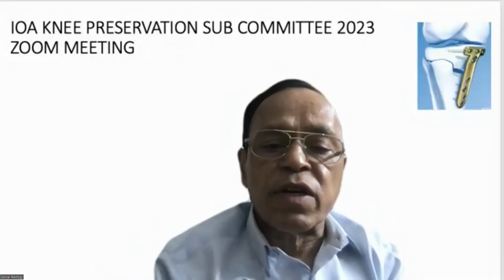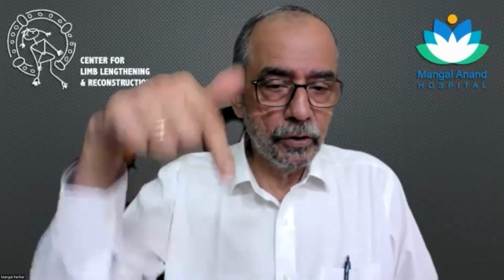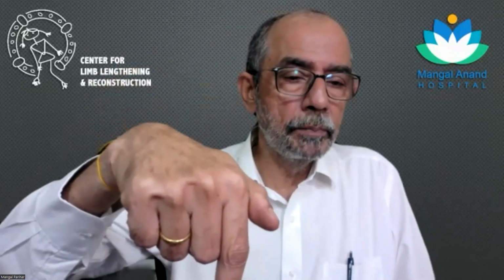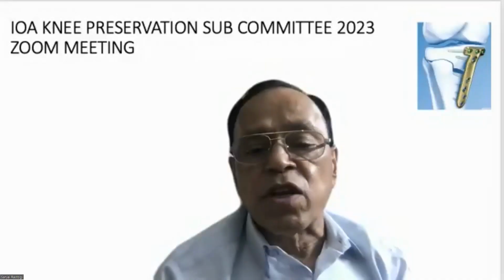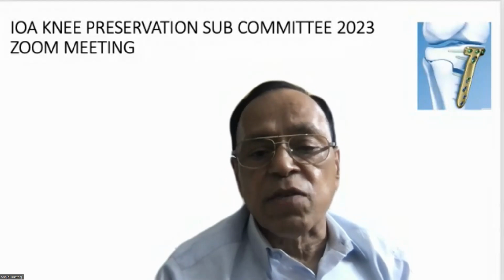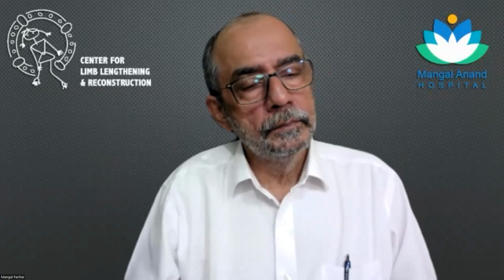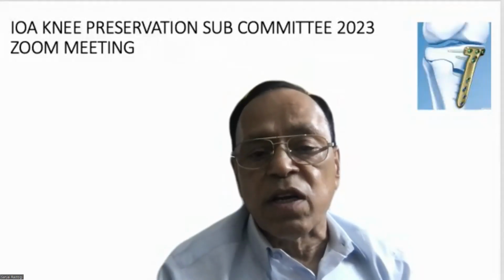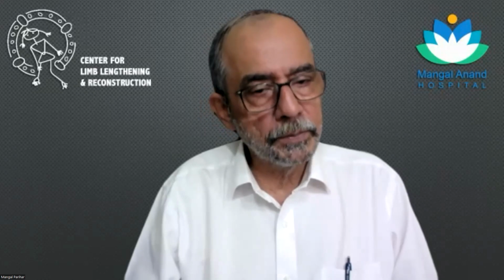Right. So what is the advantage of pie crusting once you have released it? Even after release, sometimes if you've done a large correction, you can't insert your finger between the plate and the MCL. It gets actually strangulated. By release, I'm talking of a distal release, not a transverse release. The distal release is, you see, it gets attached at 5 to 6 centimeters from the joint line. Yes. And as you retract the pes, you are in the bursa, and from there you can release it. Distally, no? Yes. That's what I'm saying.